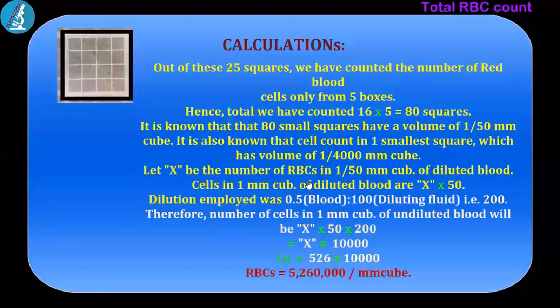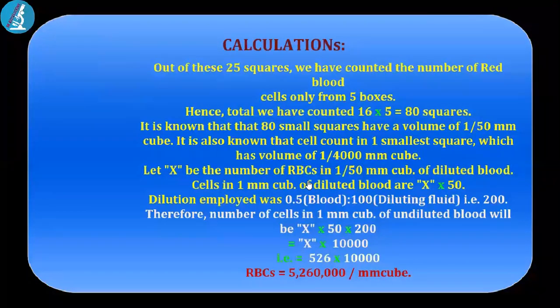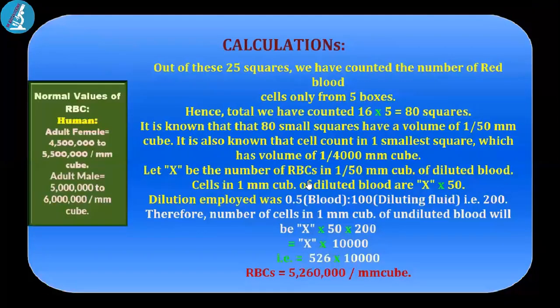Then you factor in your dilution factor, and also the area and the depth. Then you'll be able to calculate the red blood cell count, the total red blood cell count.